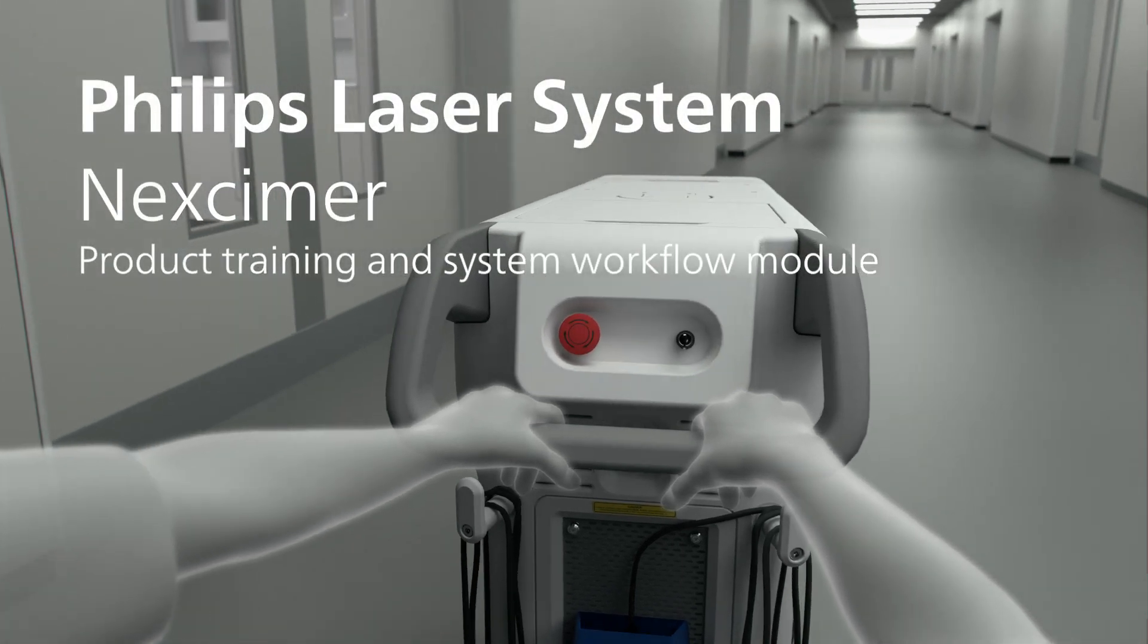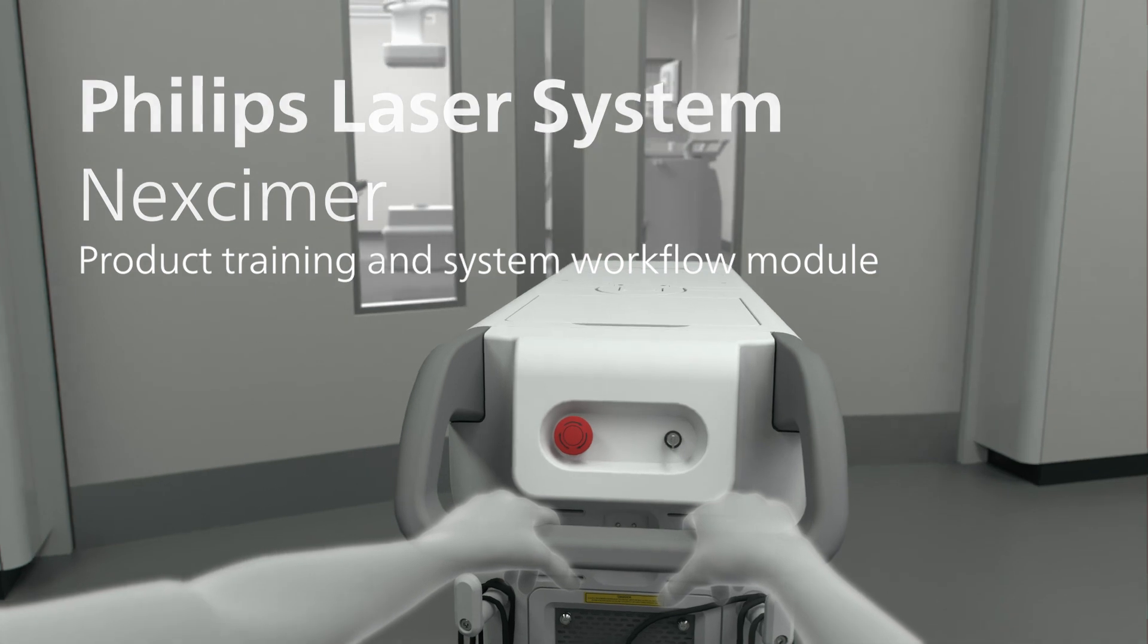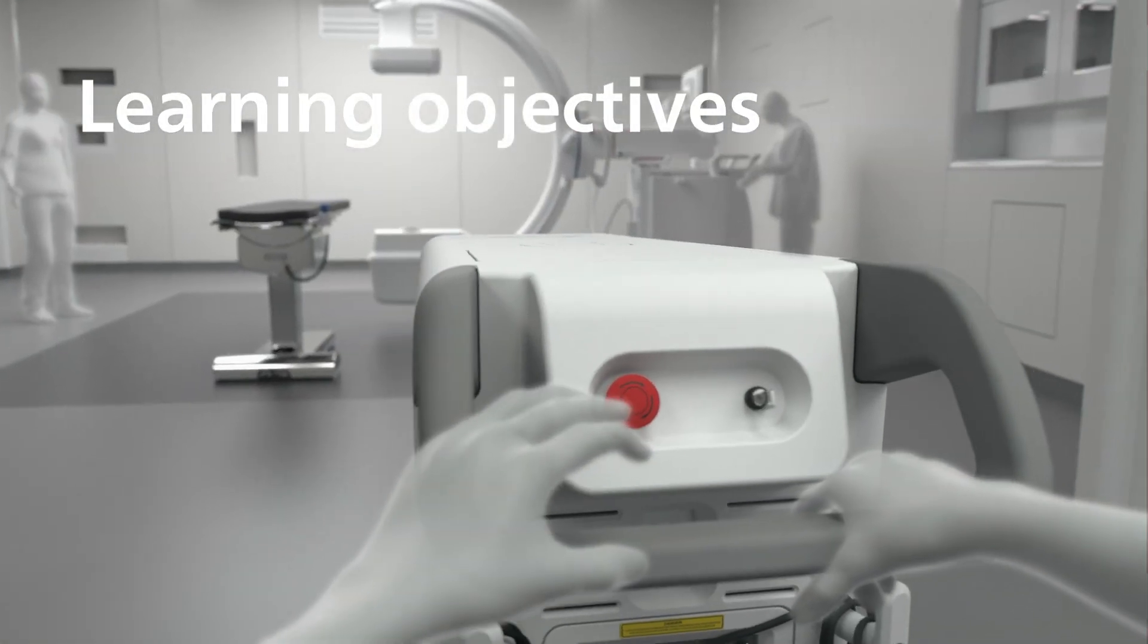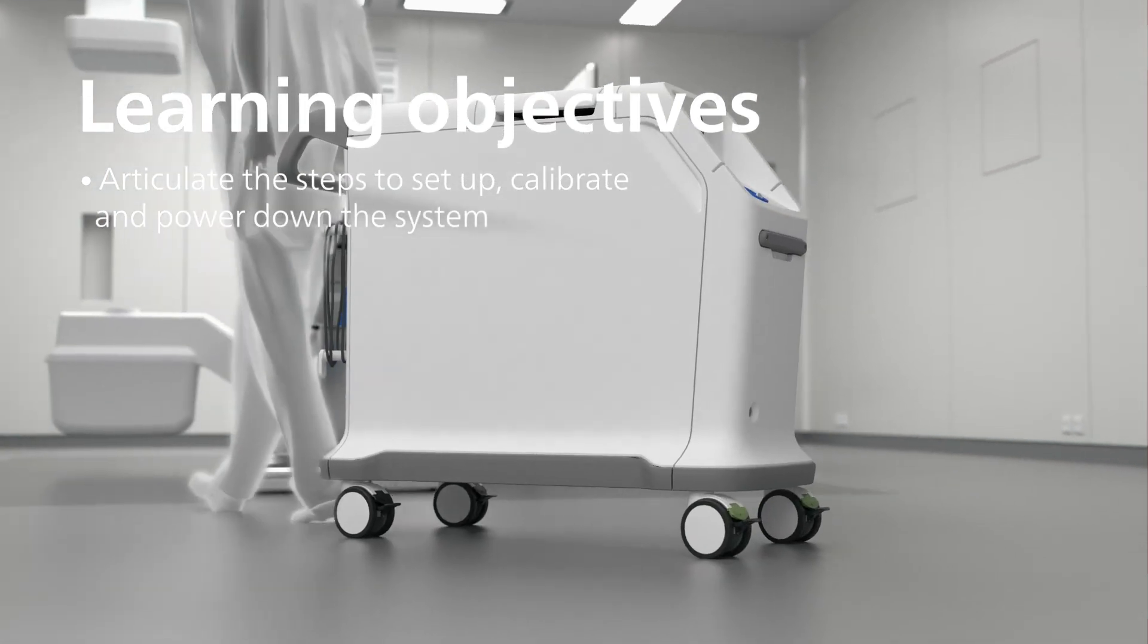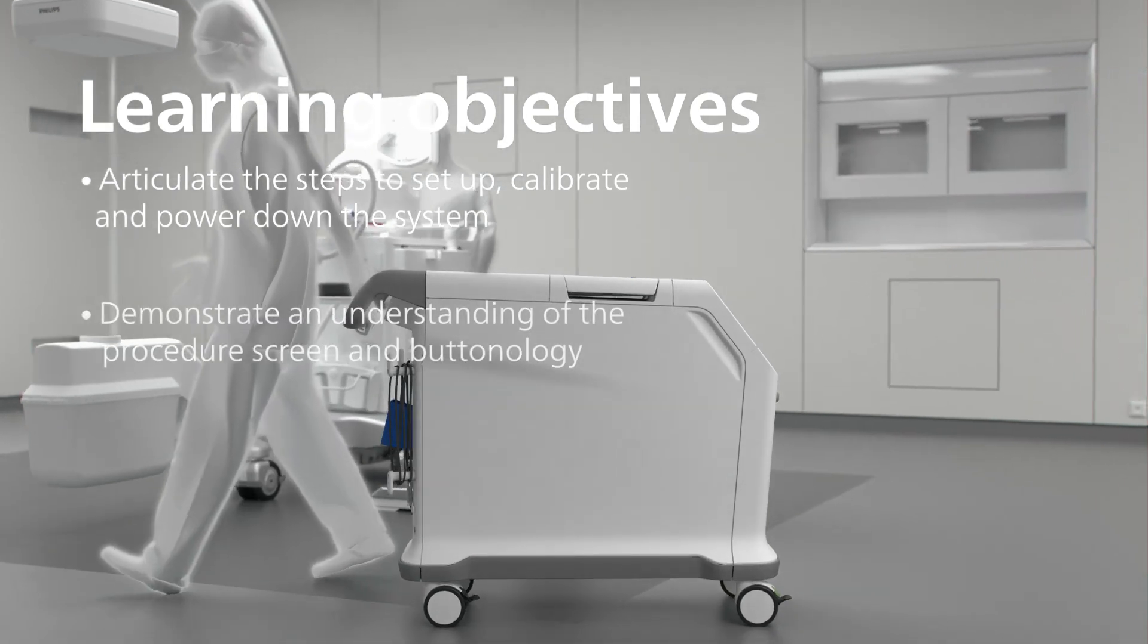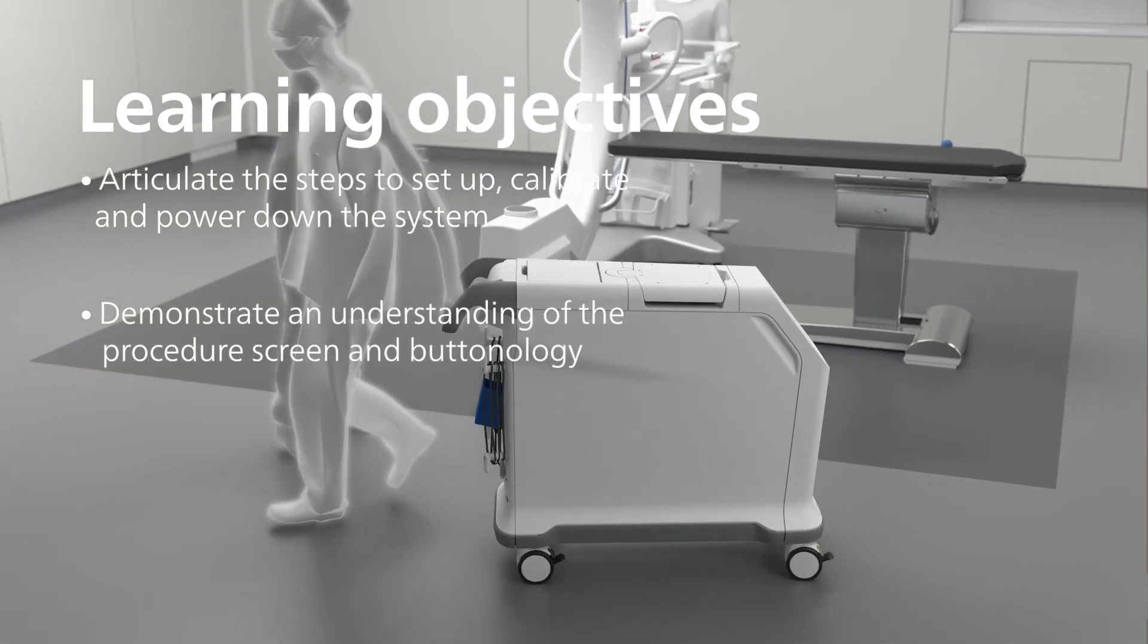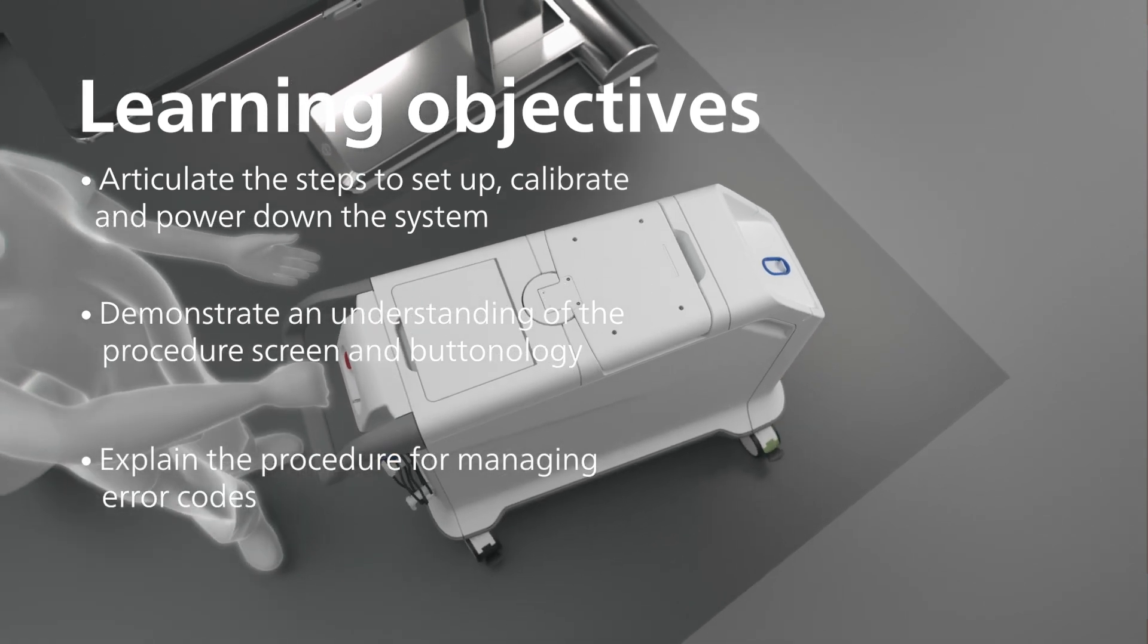Welcome to the Philips Laser System Neximer Product Training and System Workflow module. By the end of this module, you should be able to articulate the steps to set up, calibrate, and power down the Philips Laser System Neximer, demonstrate an understanding of the procedure screen and buttonology, and explain the procedure for managing error codes.